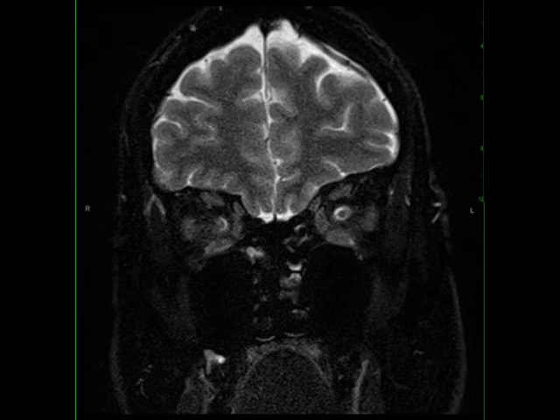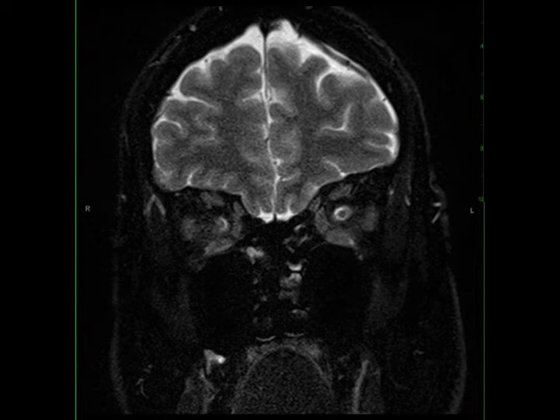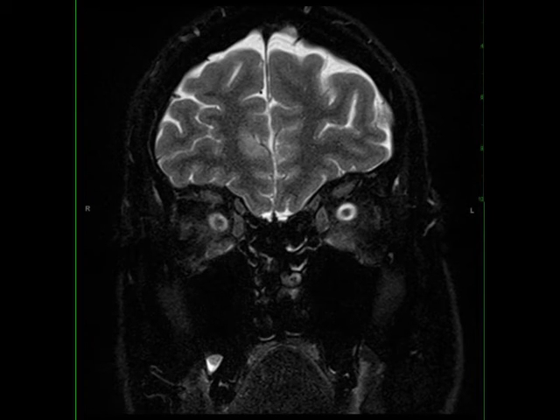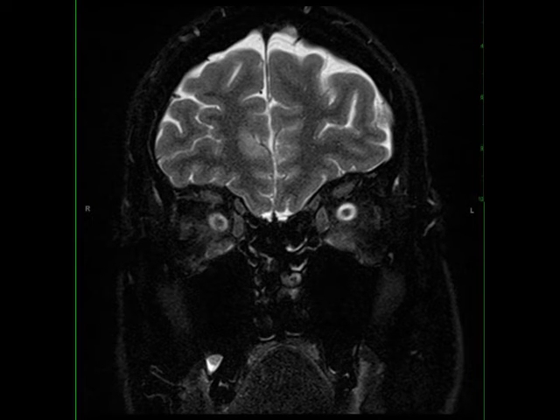On post-contrast images, there is central wispy enhancement within the optic nerve itself extending to the level of the optic disc. Findings are compatible with acute onset optic neuritis.